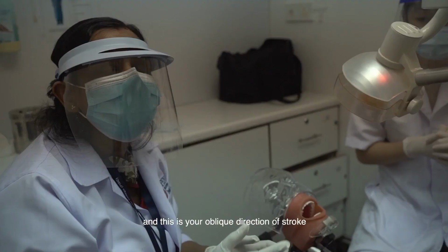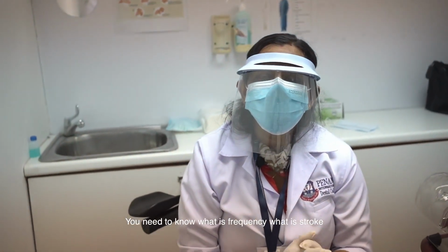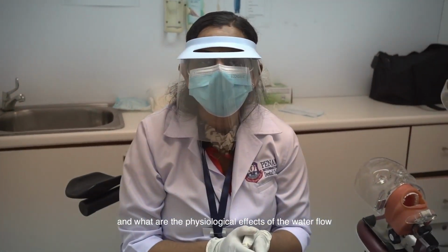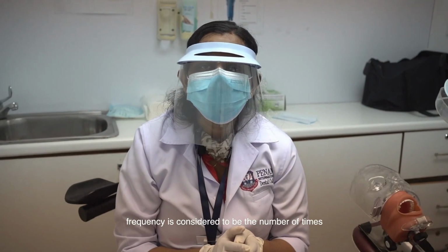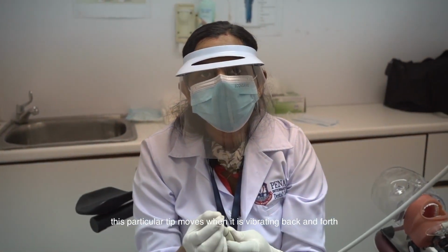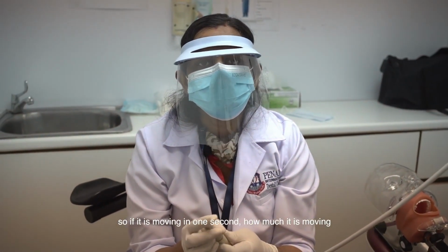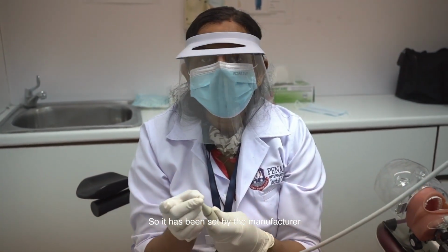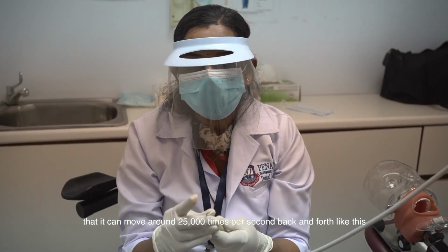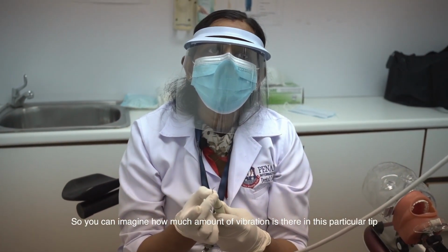When speaking about the mechanism of action of ultrasonic instrumentation, you need to know what is frequency, what is stroke, and what are the physiological effects of the water flow. Frequency is the number of times this particular tip moves when it is vibrating back and forth. So in 1 second, how much is it moving? It has been set by the manufacturer that it can move around 25,000 times per second back and forth like this. So you can imagine how much vibration there is in this particular tip.